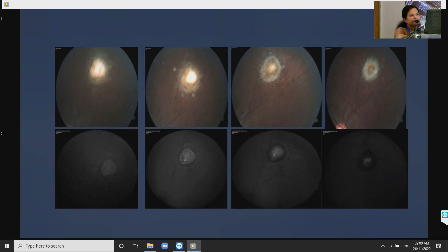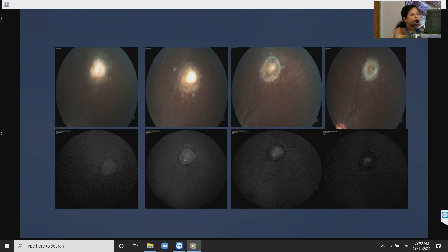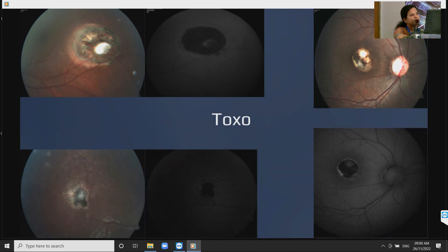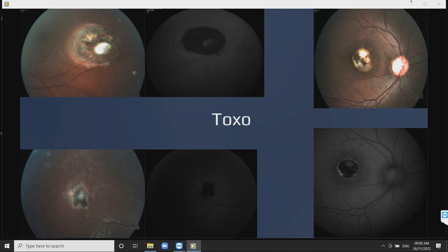In active toxoretinochoroiditis, in the active phase you can see an amorphous pattern of hyper-autofluorescence. As the lesion heals, it becomes more and more hypo-autofluorescent, and when it heals completely it becomes jet black. It also helps in detecting early reactivation of a toxo lesion.